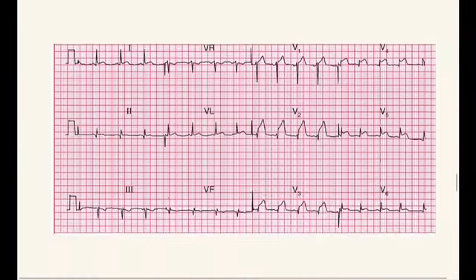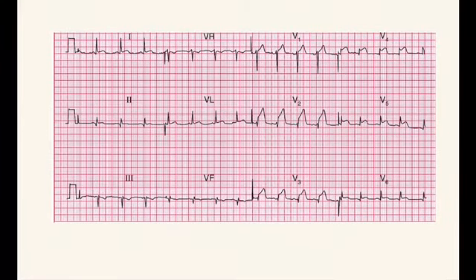Okay guys, now let's check this ECG. One important thing is that by the location of the lead in which we are finding the abnormality, we can say what the location of the infarct is. That is how the ECG helps us to diagnose the condition in myocardial infarction, because it can also give us the information about where the infarct is located.